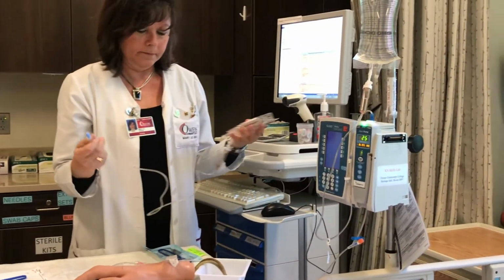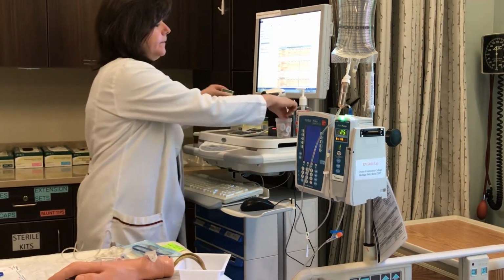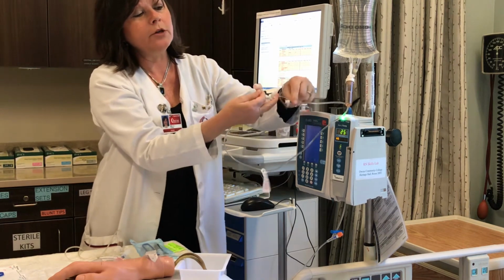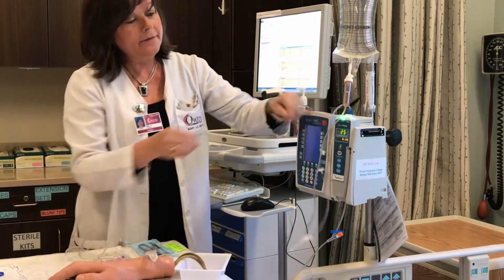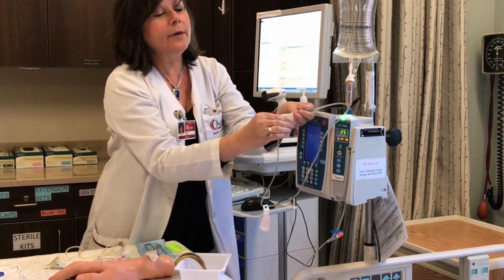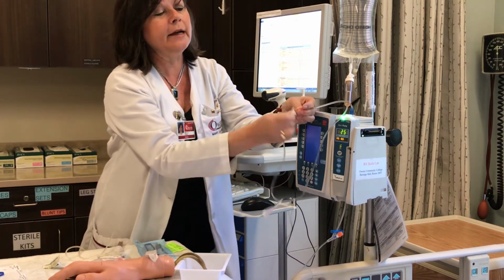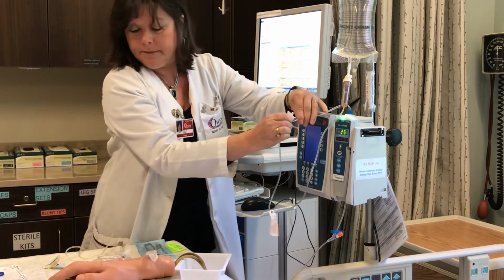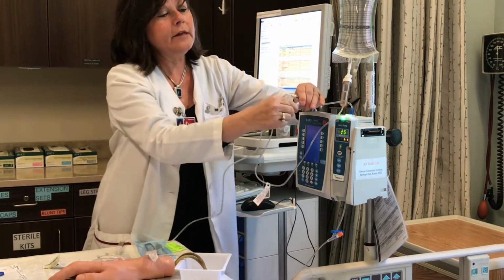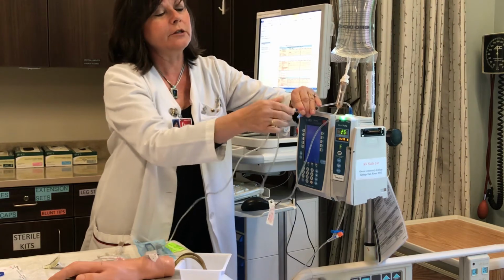Cleanse the primary IV fluid tubing injection port furthest from the patient or remove the swab cap if present. If there is an orange swab cap at this port, you would just remove the swab cap. If there is not, you can take an alcohol swab, and you want to cleanse that port on the sides and the grooves and the top for 15 to 30 seconds depending on your hospital policy. Remember to choose the port that's above the Alaris pump so that the pump is actually regulating your medication infusion.